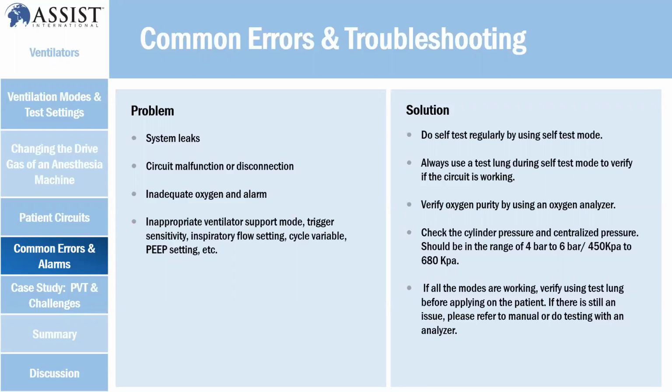So make sure you do all this testing, and if all the modes are working properly, verified using the test lung, then you can apply it to the patient. This is what normally a user is going to do, even a biomedical engineer when there's a problem. You're going to check all these four steps, but applying on a patient is not a biomedical job. Always remember, it's a user's thing.